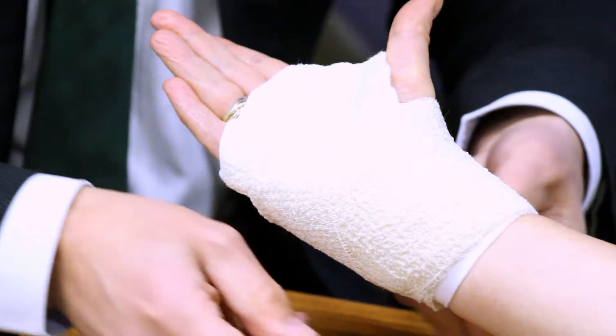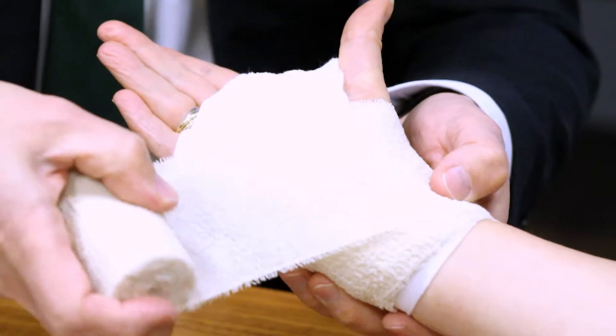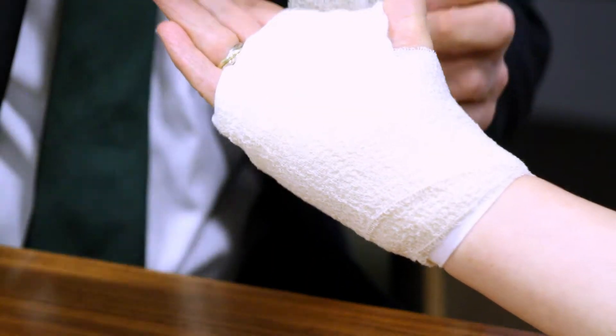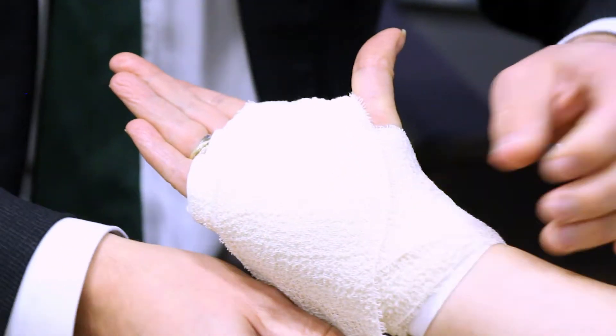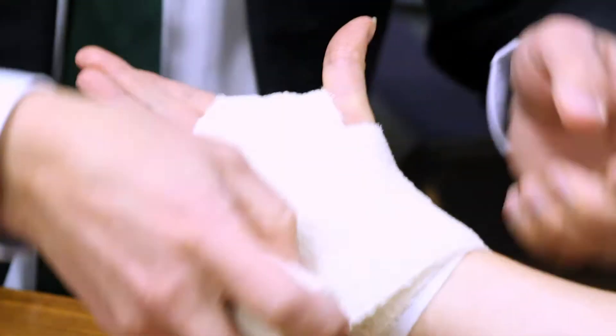And snug that right down so that that all feels nice and firm. And then we'd usually trim this a little bit shorter with some scissors, and then put some sticky tape on that to hold that in place.